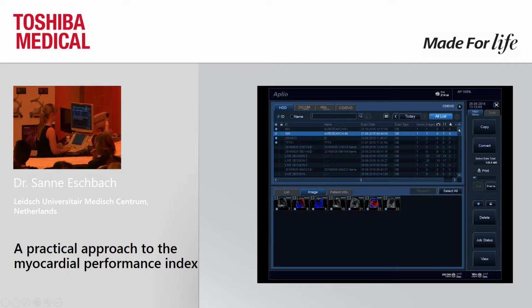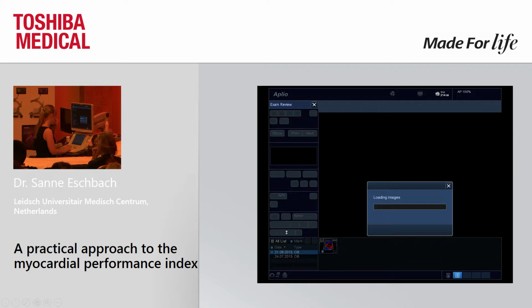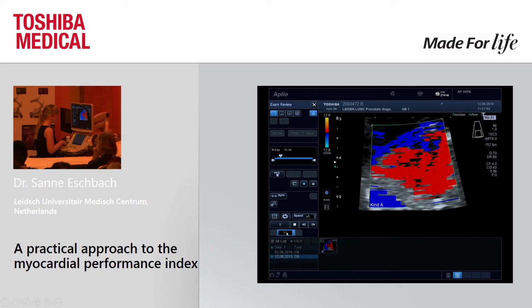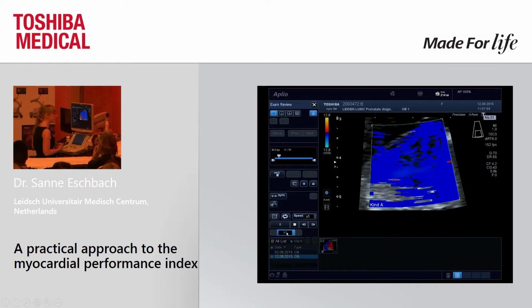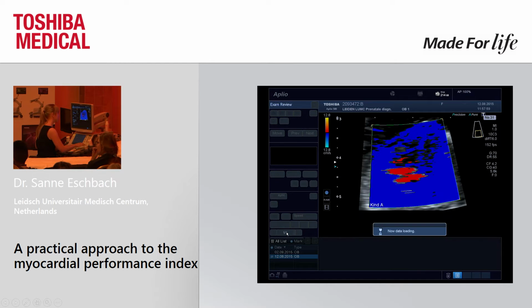So then I want to show you one of my clips of one of the TTTS recipients who developed a right ventricular outflow tract obstruction at time of diagnosis of TTTS. So this is the ultrasound I made at that moment that they came in with the diagnosis. It's a younger heart, about 16 weeks old, and there was no flow over the pulmonary valve. So we were very curious what would happen with the myocardial motion if we measured it.